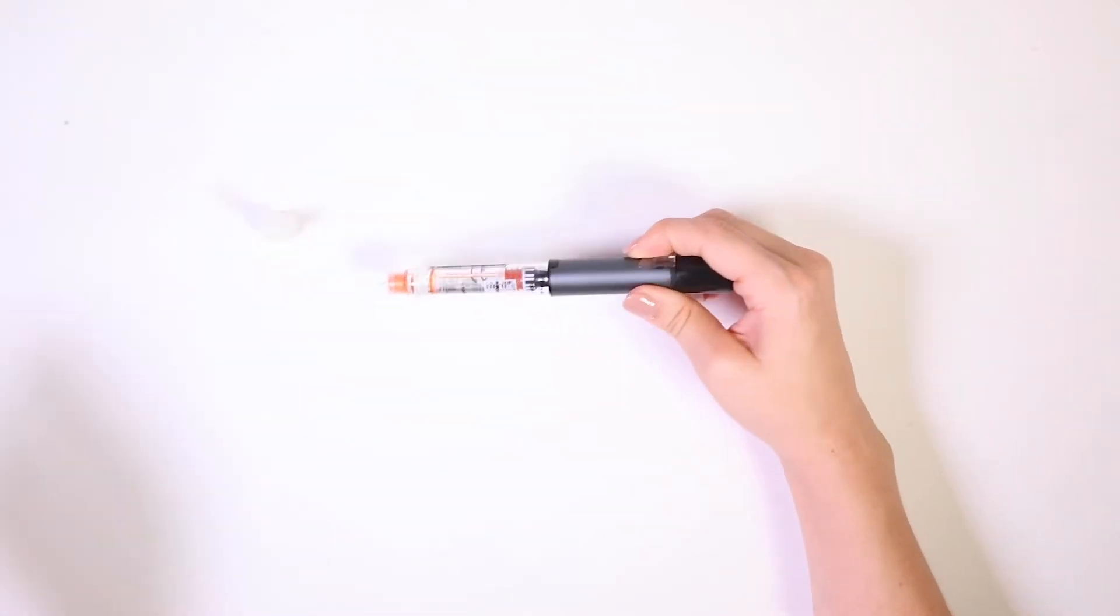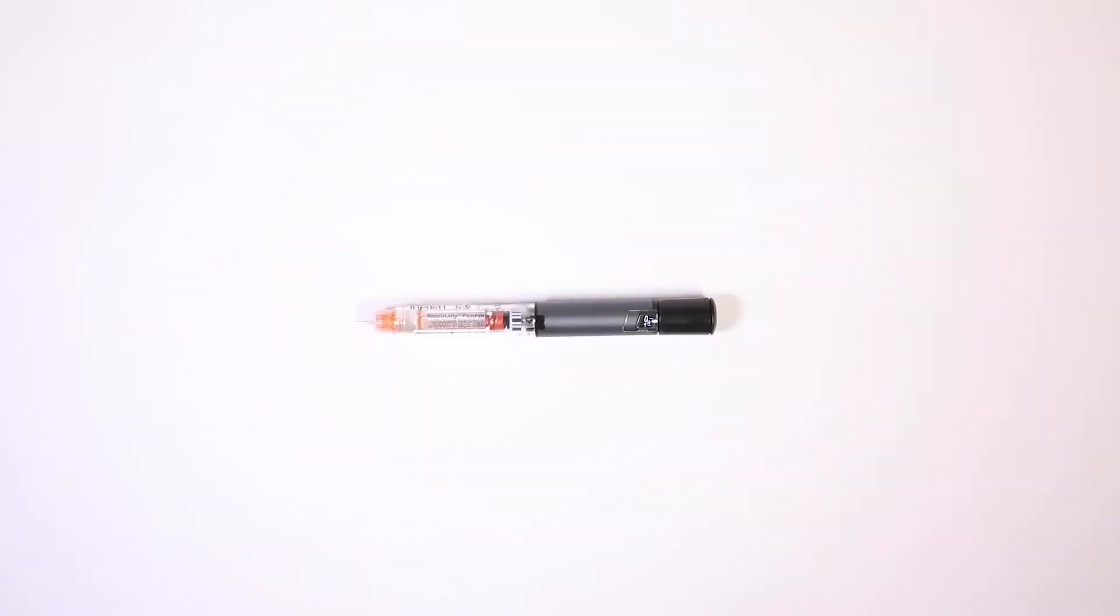Be sure to also remove the inner needle cover and throw it away. Priming the pen removes air from the needle and ensures your full dose is delivered. Be sure to prime before every dose.